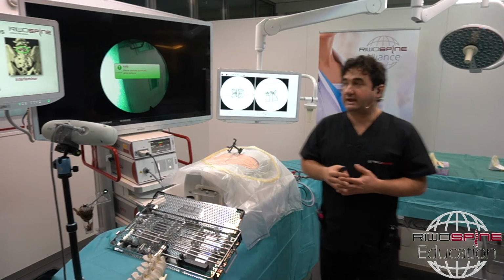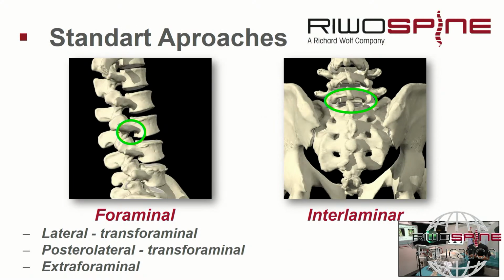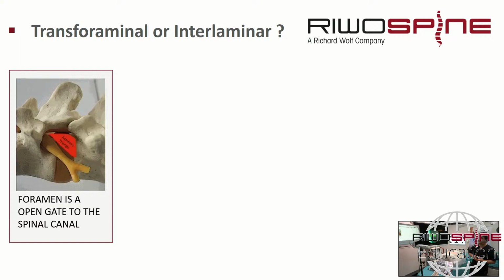As you know, we have two standard approaches. If you use the foramen, we call it the foraminal approach, well known as transforaminal. The second is the interlaminar approach, if you use the spaces between two laminas. Which approach to select is always a big question, and it depends a little on the surgeon's experience. In this case, we would like to share our experience with you.